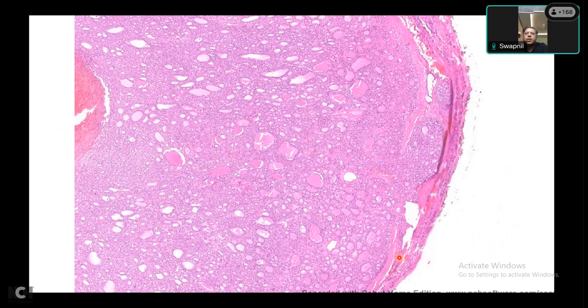It is not on the lines of multinodular. So you could have multiple nodules like this, but it's not something that you should consider as a multinodular disease or a follicular nodular disease. So at low magnification itself, to me, this points towards a neoplastic disease with some sort of a capsule around the lesion, and obviously there is a predominant follicular or microfollicular pattern.